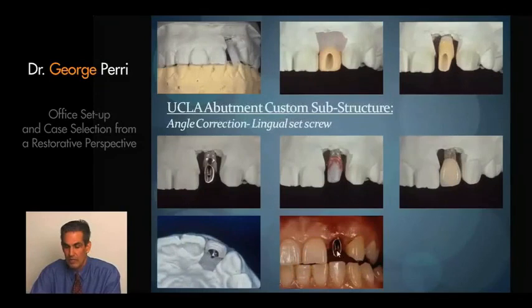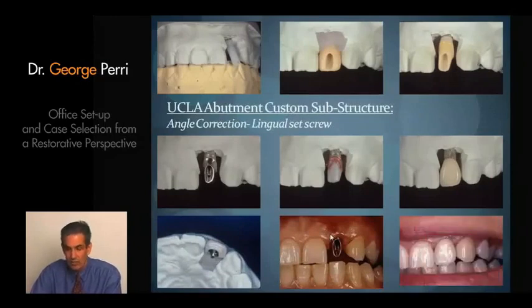First the abutment is placed, and I should point out on this picture, we see a little bit of enhanced redness in that area, and for me as a restorative dentist, I would be concerned about the amount of bone that's in this area with that labial implant placement with labial inclination. But the final result can be very reasonable. It could be screw retained, or from a lingual set screw, or cemented based on your long-term comfort zone with this case.